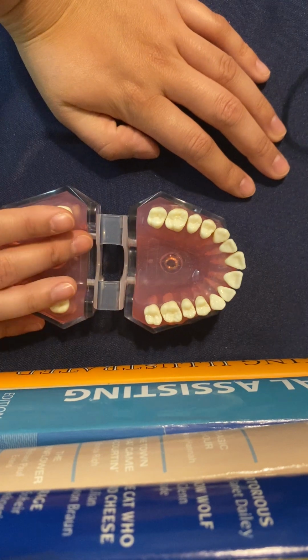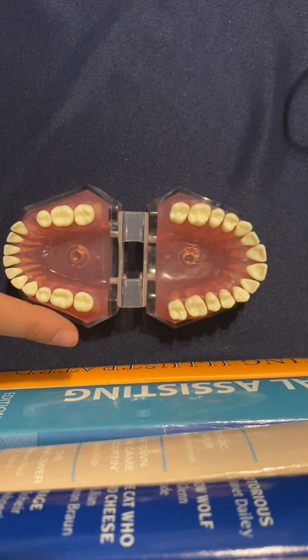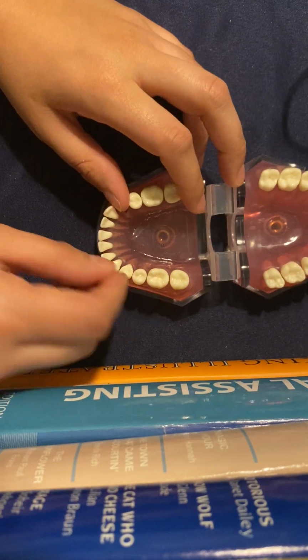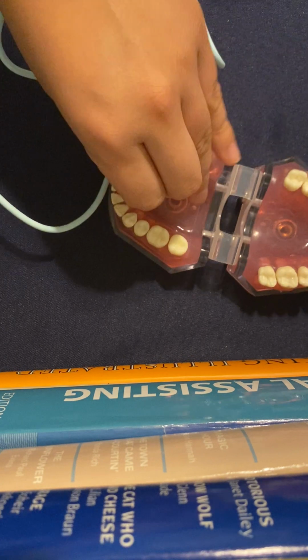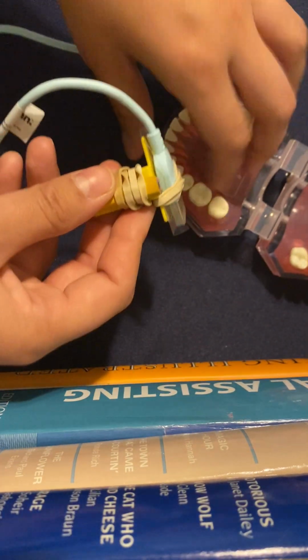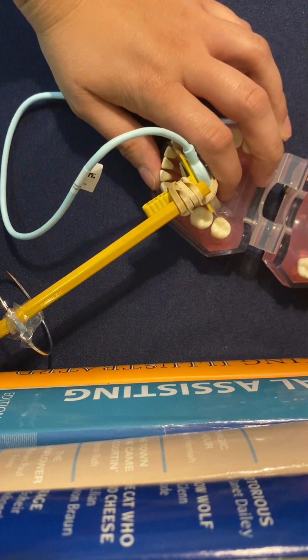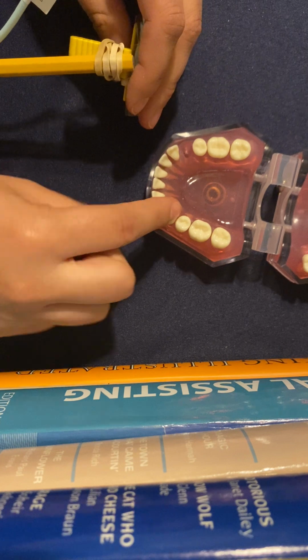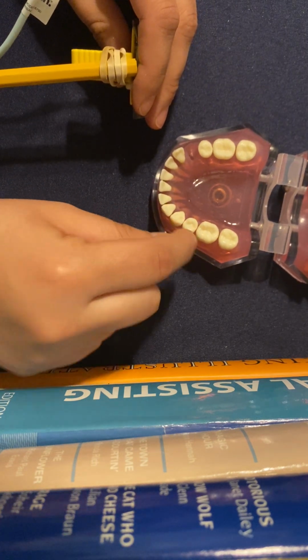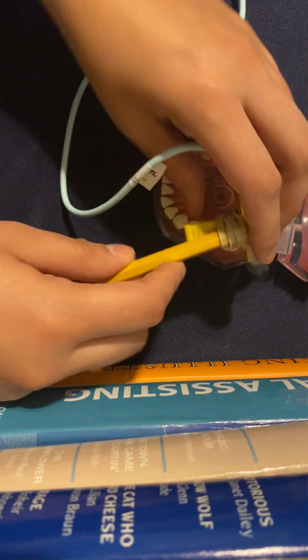Okay, now we're doing the mandibular left premolar. So that would be this. The reason they do it like this is because they don't want to have to flip this around, and it won't take so much time. So for the mandibular premolar, you're going to want to center it on the second premolar, this one right here. I almost grabbed the wrong one. So I want to center it on that.